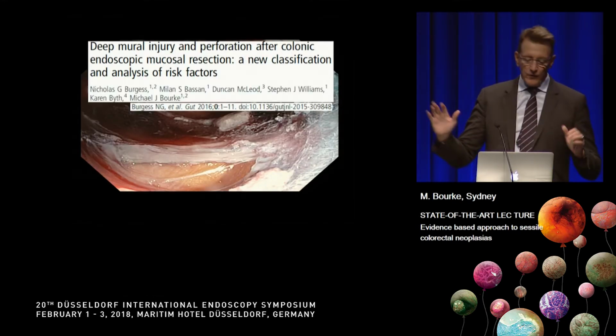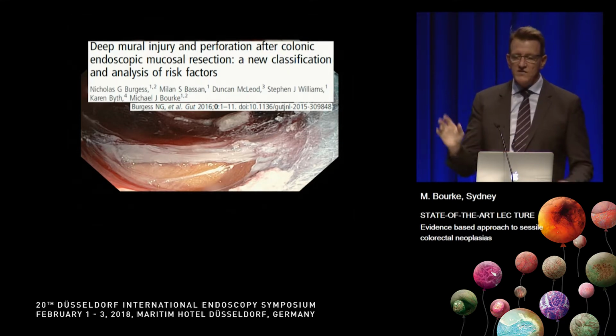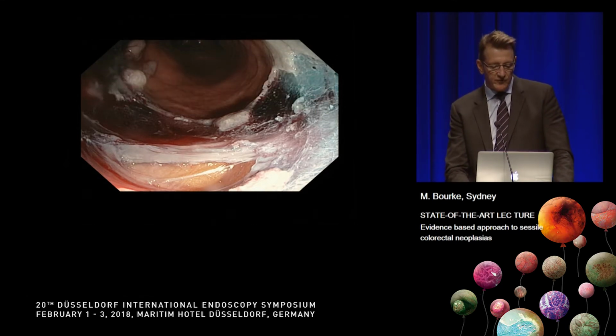So having done all that, what about risk factors for complications? So I think bleeding, we know, is associated with right colon location, and we don't have an effective treatment. Perforation is not common now with EMR, 1 or 2%, and there are stigmata that you should look for that are not frank perforations at the time of the resection, which alert you to the possibility.